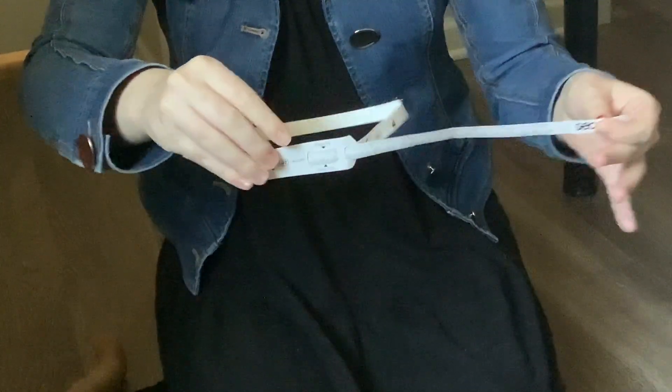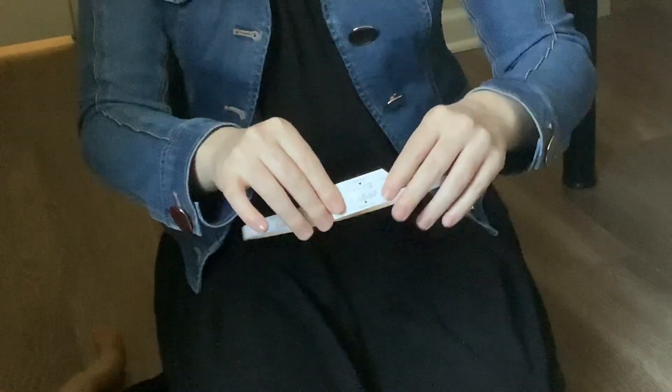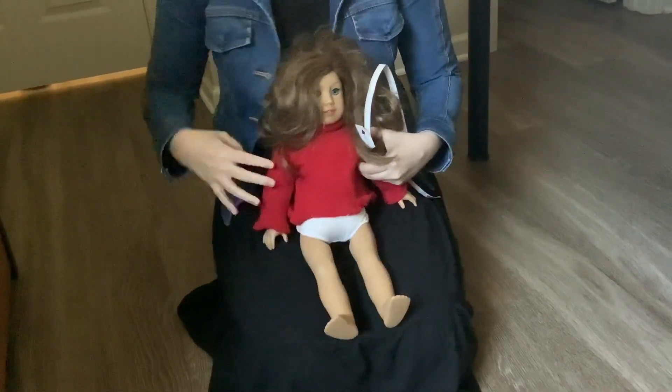At this point, the tape should be able to be pulled quite easily. From there, you're going to want to gather your helper if it is time to do it during the visit. The helper is going to be needed to hold down the baby's arms so they do not take the tape off of their forehead.